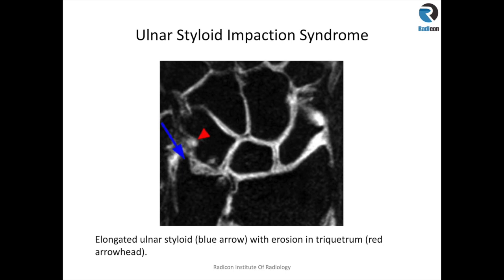That is a case of ulnar impaction. In this case, there is also ulnar lunate abutment or ulnar carpal abutment. You can see cystic change in the distal ulnar and cystic change in the triquetrum. There is likely a central perforation in the TFC disc as well — you can't see any TFC between the ulnar and the lunate on this image.